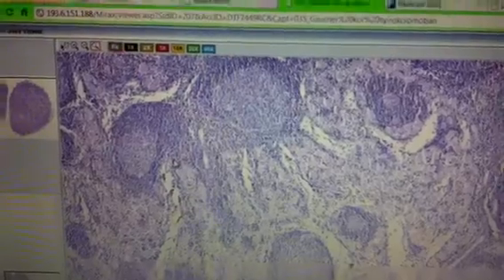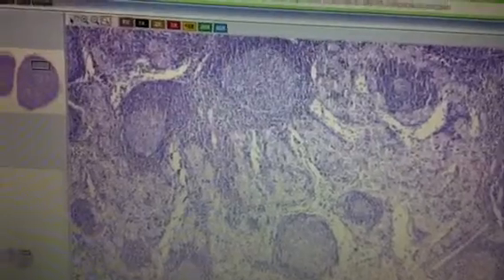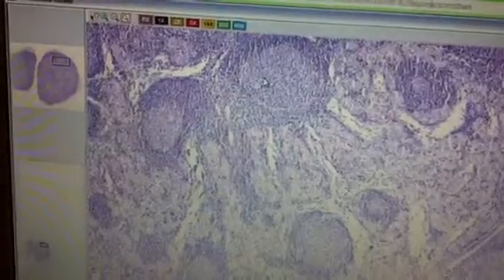So just the PAS positive macrophages, and there are cortical areas that contain secondary lymphatic follicles, which we are in the cortex, and these are the follicles we're talking about. And yeah, you're supposed to see something called Gaucher cells or something, and I'm guessing that's the macrophages with the specific stain.